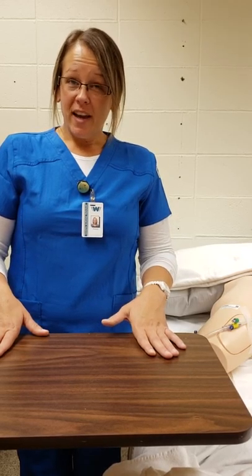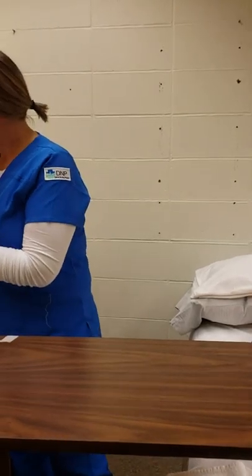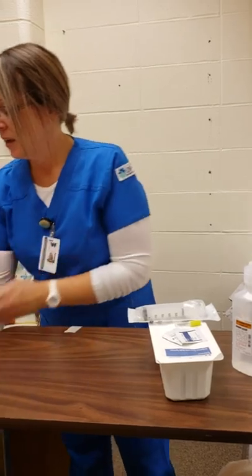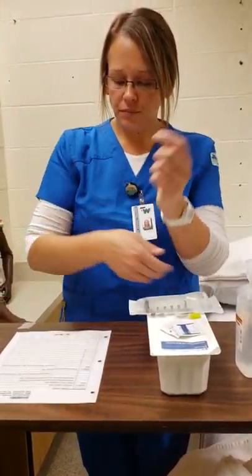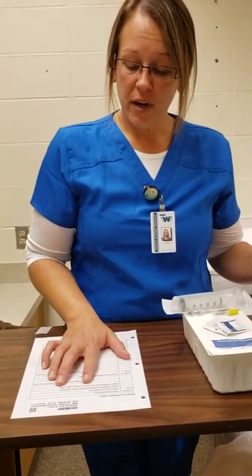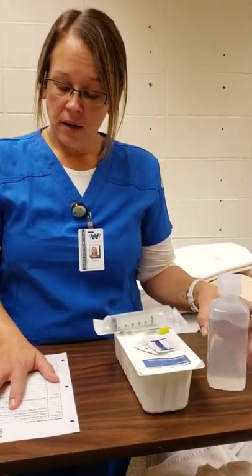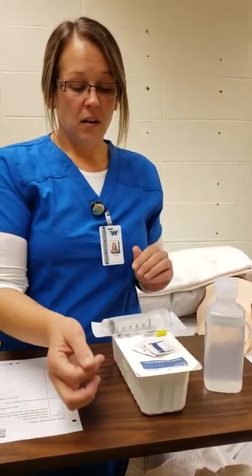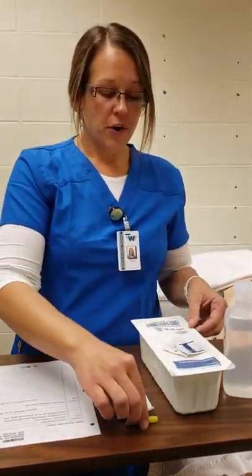Now I'm going to irrigate my catheter, making sure I have all my supplies and the doctor's orders. For the irrigation I have 30 mL of 0.9% normal saline, an irrigation needle and irrigation syringe, and a sterile irrigation tray. I verify everything is there.